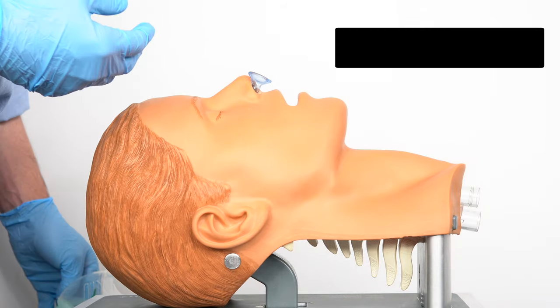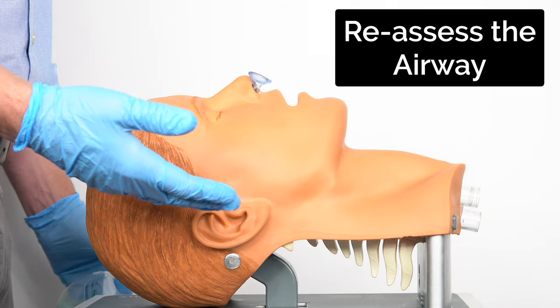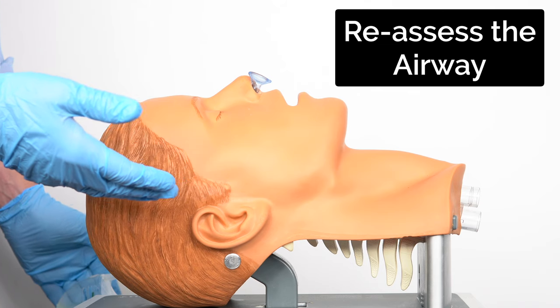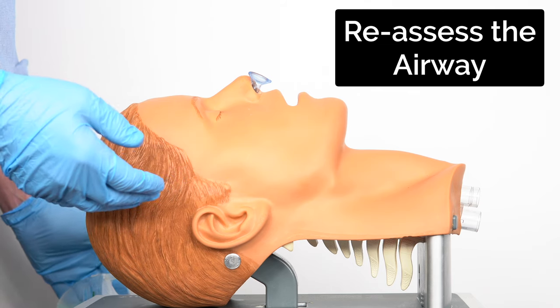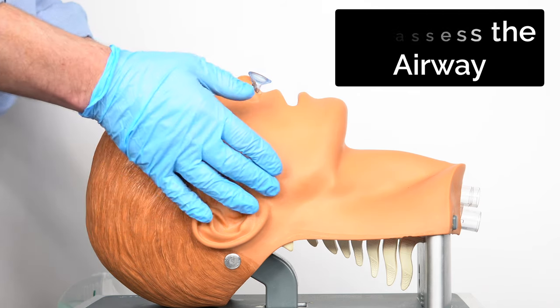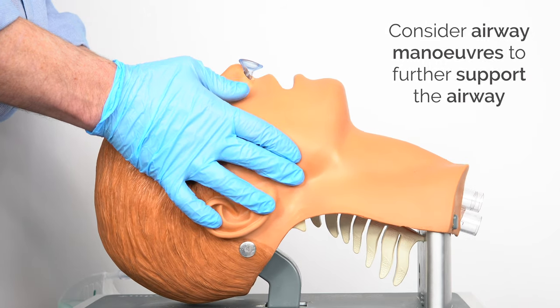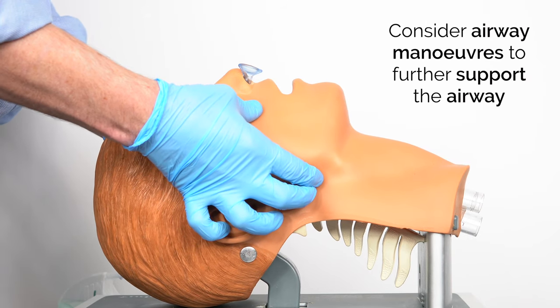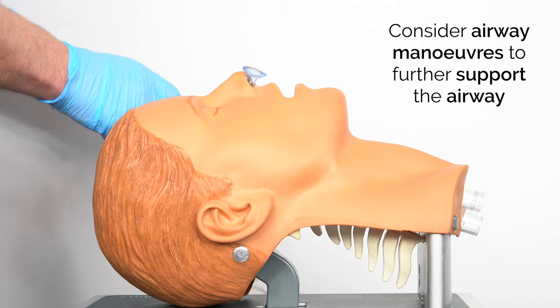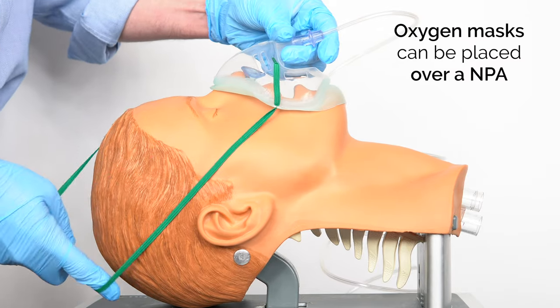Once the nasopharyngeal airway is in, it's important to reassess the patient and make sure they have a patent airway and that this is allowing them to ventilate. You may still need to perform some simple airway opening manoeuvres to help support their airway, and also once it is in, you may need to support the patient by giving them extra oxygen.